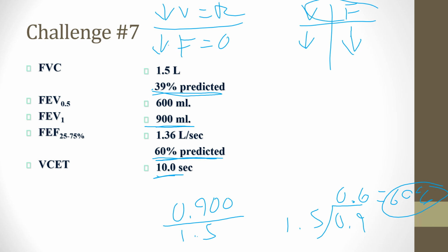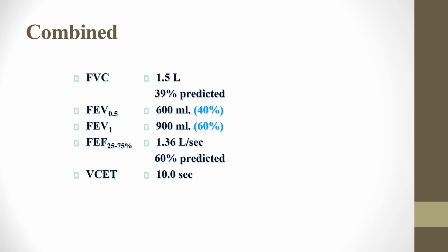So this looks like it could be a combined issue. This is the big case here on this patient. Let's say we did get a slow vital capacity, and the slow vital capacity was 80% of predicted. Then that would show this patient has that air trapping thing going on, that premature closure of the airways. They didn't get it on this patient, so therefore it looks like, without any further information, this patient has a combined condition. Yep, this would be a combined condition. Without further information, we have to go with what we have. So in theory, they would be treating this patient as if they had both, because we just did not attain that second slow vital capacity test.